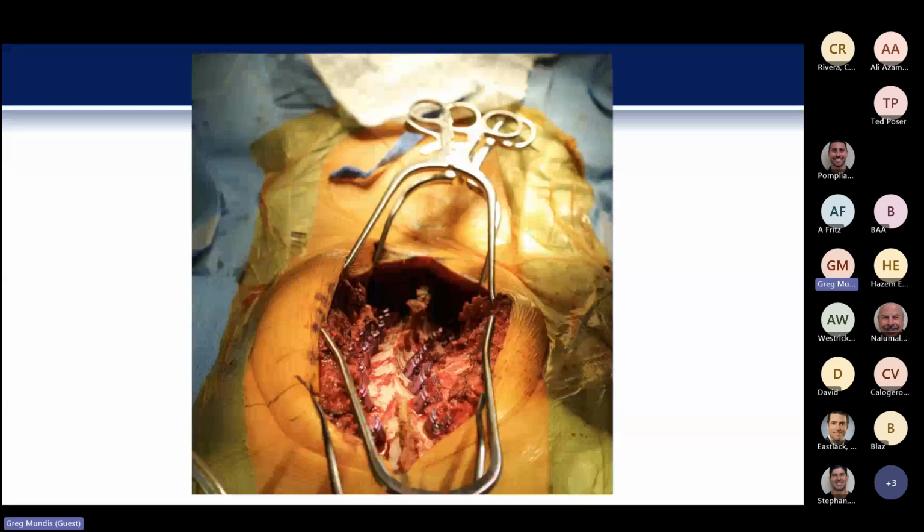So once the screws are in, you'll get a better sense of how everything lies. Now, the types of screws you use can matter as well, and in general, I like to use uniplanar screws. Uniplanar screws allow for some flexibility in the sagittal plane, but in the coronal plane are pretty darn stiff.